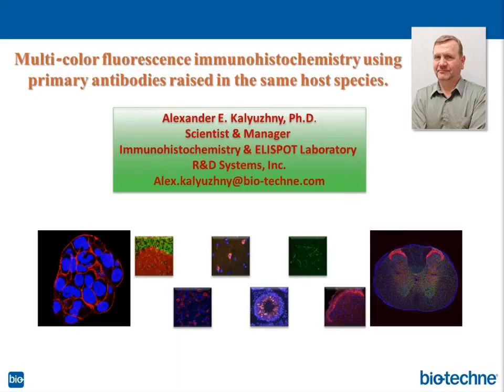A positive control is easier to do because first you do single color experiments and compare your hapten-conjugated primary antibody. For example, we'll take the DIG-labeled primary antibodies again. You compare your staining, your signal, when you do single color with the DIG-conjugated primary antibody and with the unconjugated primary antibody. Your signal is supposed to be the same in terms of intensity and localization. That's how I see doing these controls.